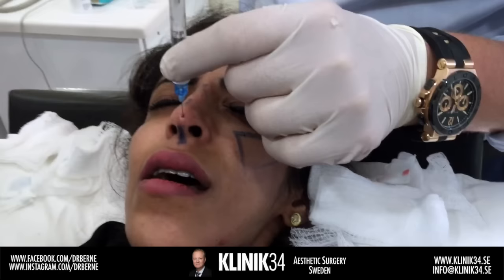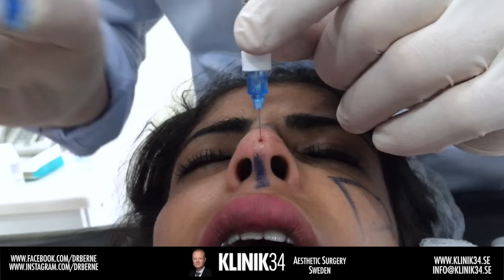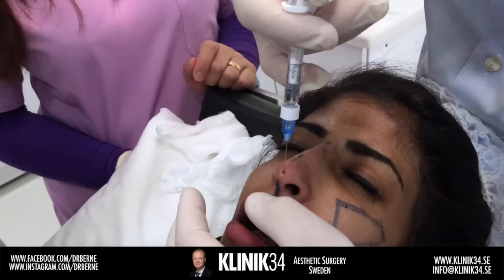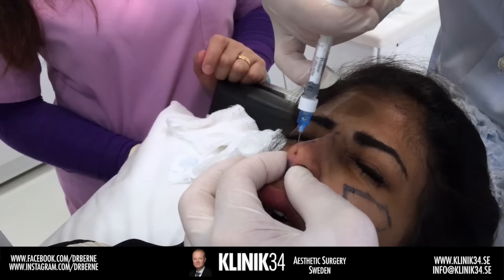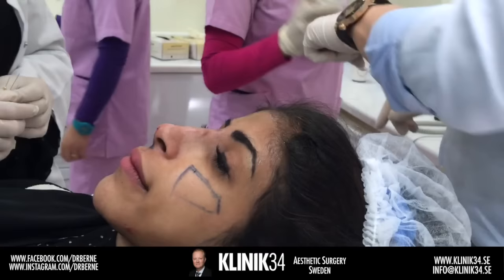We need to understand where we are located — you can see how deep we are, basically on the bone. This will give support and push up the tip of the nose. I will also inject in the septum which will open up the nasolabial angle. Almost done — we need a small touch-up, and that was one entry point — we've changed the proportions of the nose.